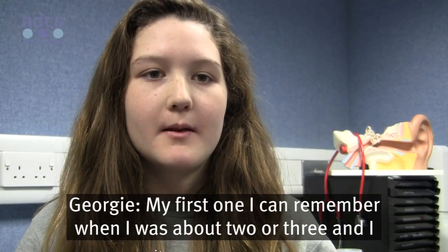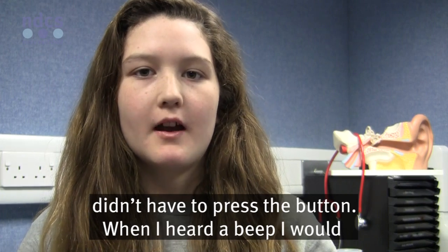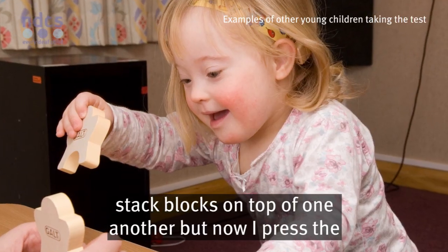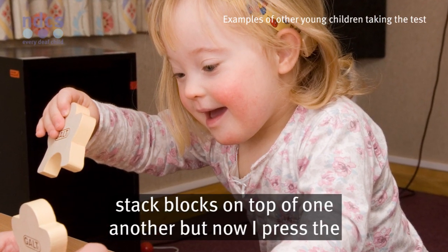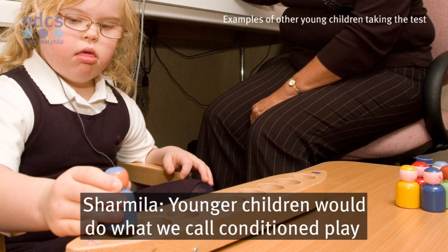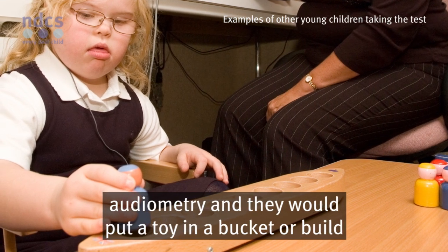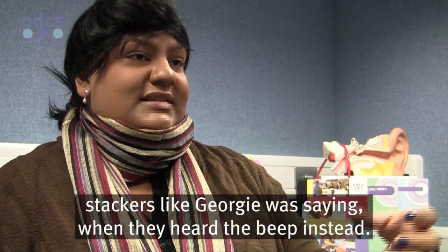My first one I can remember was when I was about two or three, and I didn't have to press the button. When I heard a beep, I would stack blocks on top of one another. But now I press the button when there's a beep. Younger children would do what we call conditioned play audiometry, and they would put a toy in a bucket or build stackers, like Georgie was saying, when they heard the beep instead.